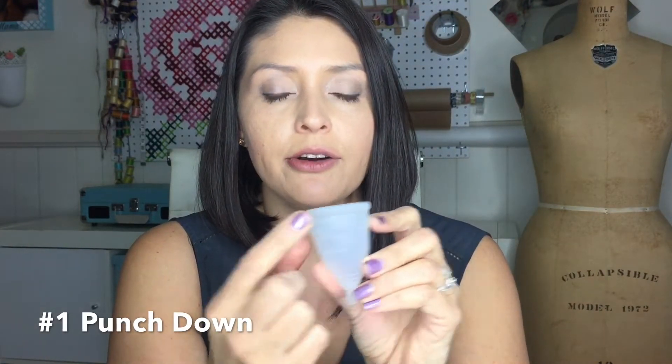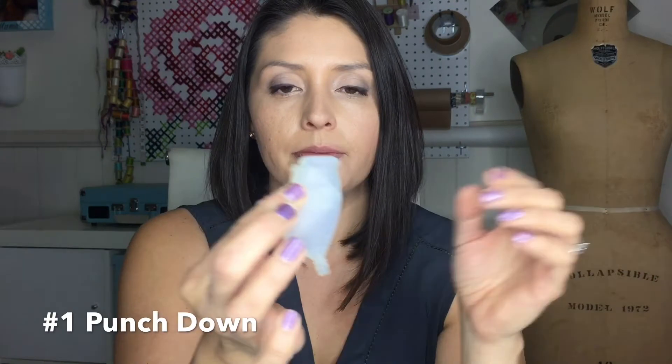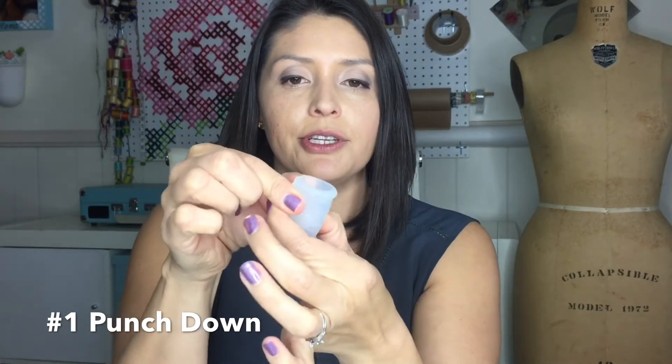I'm going to show you two methods on how to insert the cup. The first one is called the punch-down method. What you do is punch down over one of those little air holes — it will help you insert it evenly. When you punch down on one corner like this, it's going to create an air bubble down here, and it's also going to look like a C or U depending on how you look at it.